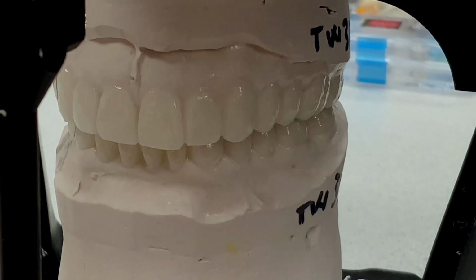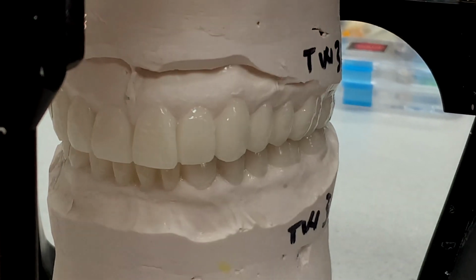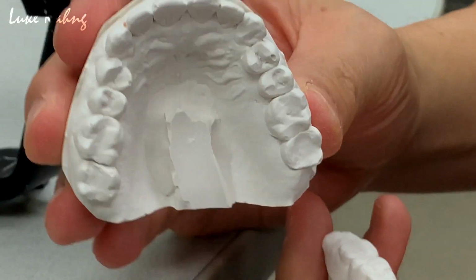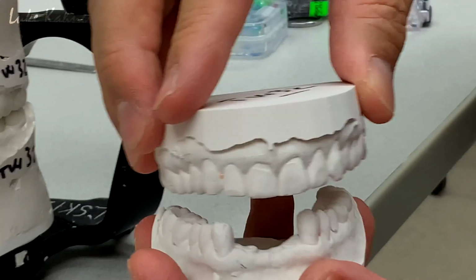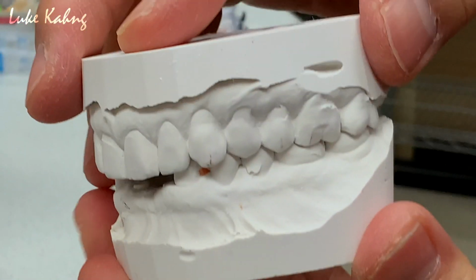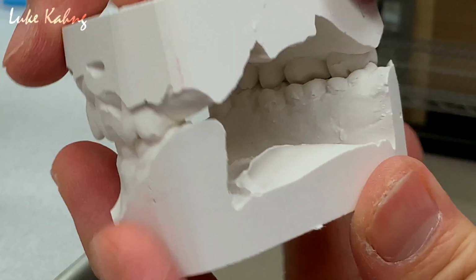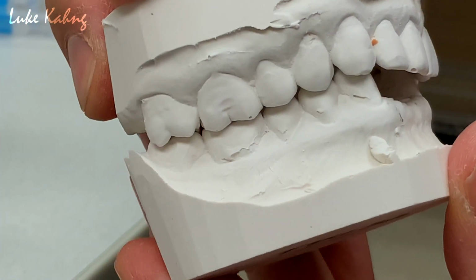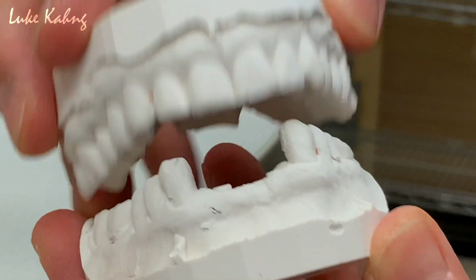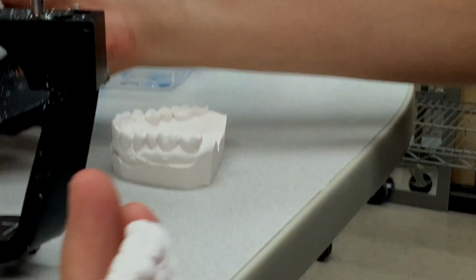Okay, so here's what I'm going to do. We have a model from this, and look at this occlusion. Whenever we have a model that is really deep, I have to extend the vertical dimension, open the bite. Here same thing too, so we can open it. It's a really deep bite, so we open it technically. And then we build up the lower 22 through 27, just like that.